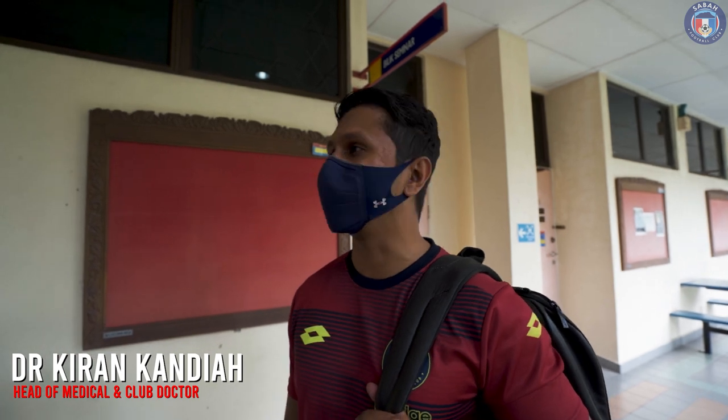Oh hey Doc! Hi, so today we're in UMS. We're doing Part 2 of our pre-season testing. Today will be the isokinetic testing for players. If you remember Part 1, we did the medical side. So now we're doing the strength measurement side.